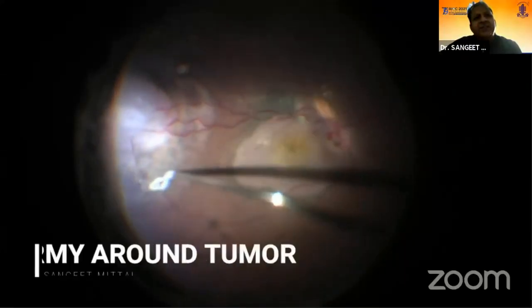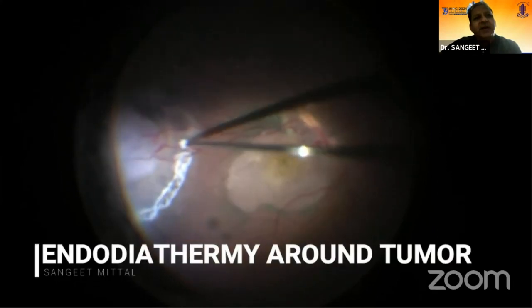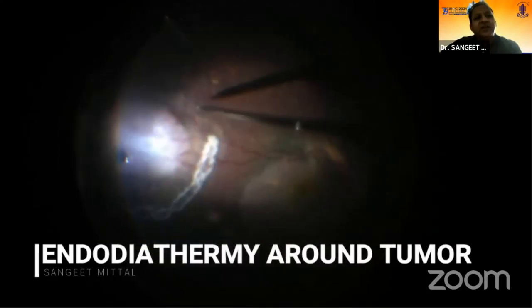And in this patient, we did endodiathermy around this tumor site, and first of all, I thought it would only be a retinal hemangioma. I'll just take out the angioma, but when we tried to excise the angioma, it was very adherent to the underlying choroid. So we had to do a chorioretinectomy in this patient.